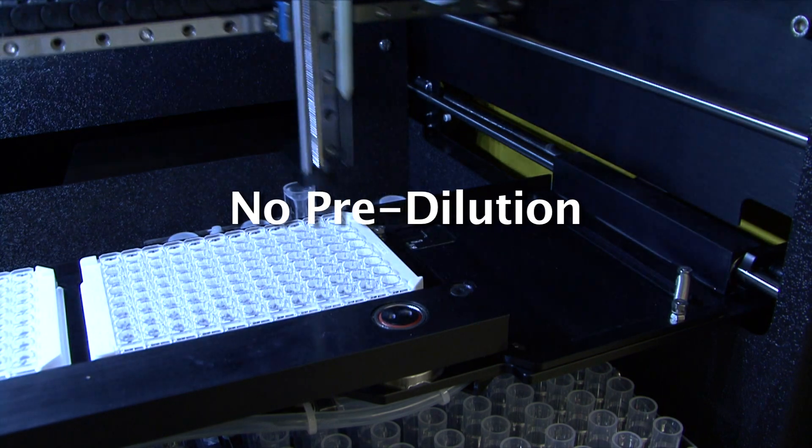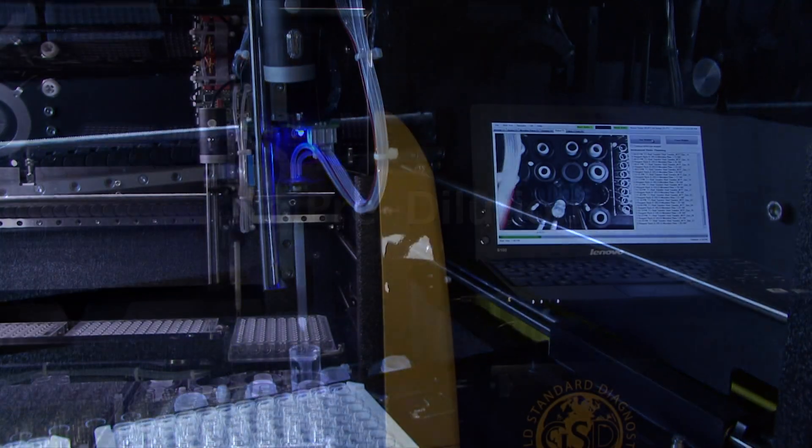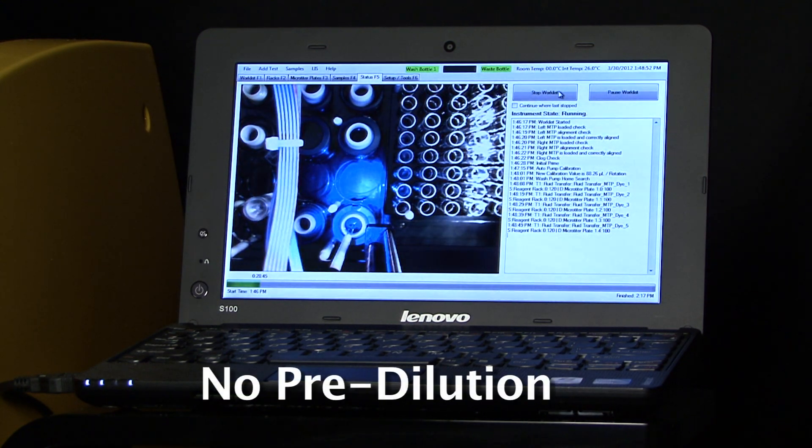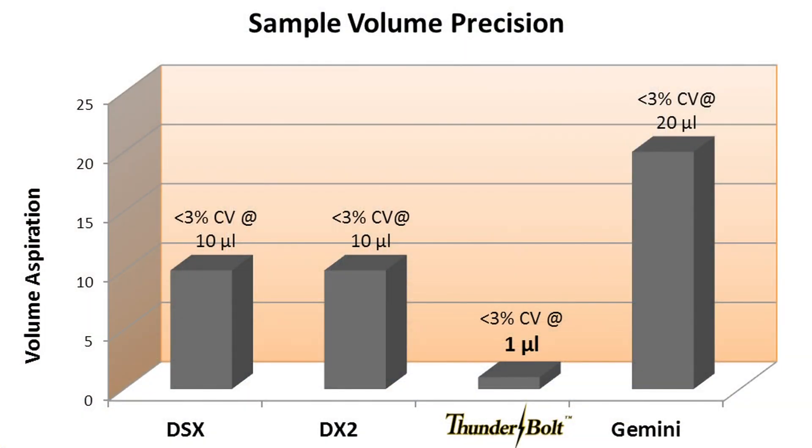No pre-dilution. The Thunderbolt aspirates 1 microliter with less than 3% CV, eliminating pre-dilution processing steps. Compared to competitors, the Thunderbolt maintains the same level of precision at much lower volumes.